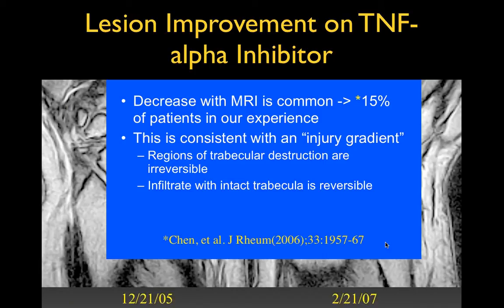The fluid inside the joint, which is encapsulated, obviously increases the pressure of the joint. And it's almost like a herniation plus an erosive change that destroys the trabecular bone. I'm not sure how much of that the disease causes, synovial hypertrophy.